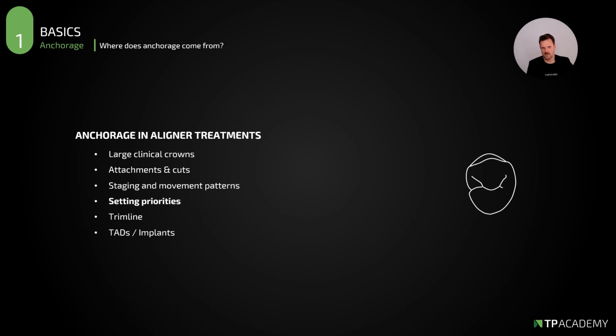We need to set the right priorities. For me, this is, wow, one of the most important things in digital treatment planning, and also something where I see the most of the mistakes. Why?